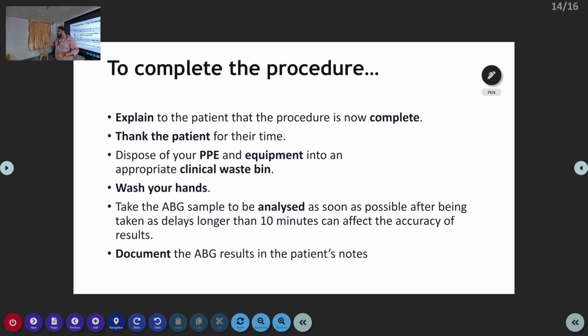If you are looking for additional parameters, that is different. You don't need an A; you can take it with a V also. For oxygenation, definitely you need an A. For ventilation, you need an A. But for acid-base status, a VBG will also do well. For all other purposes, a VBG is enough. If you want to know electrolytes, lactate, all those things, a VBG is enough.